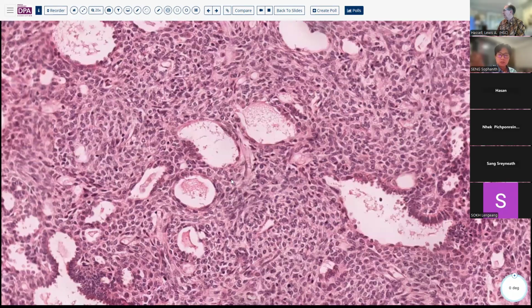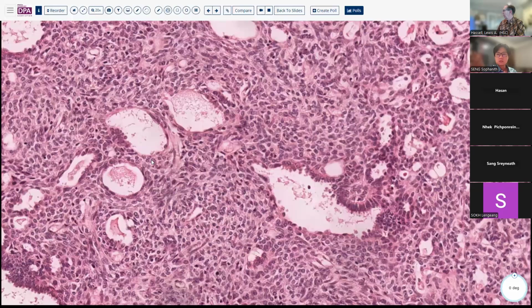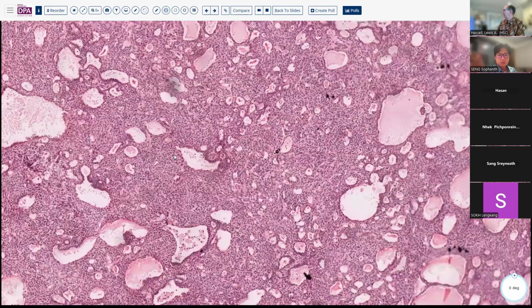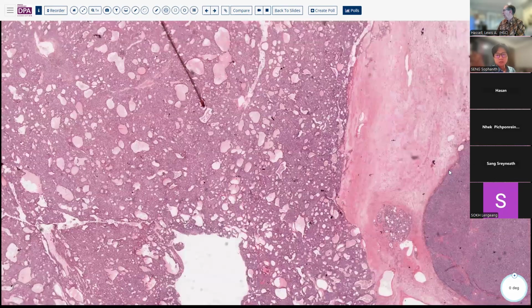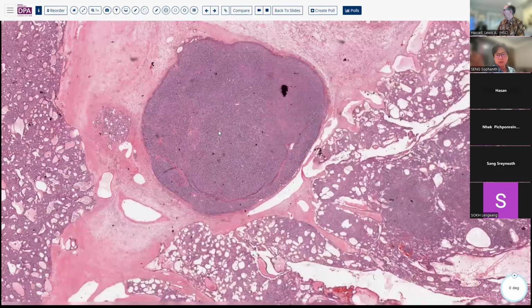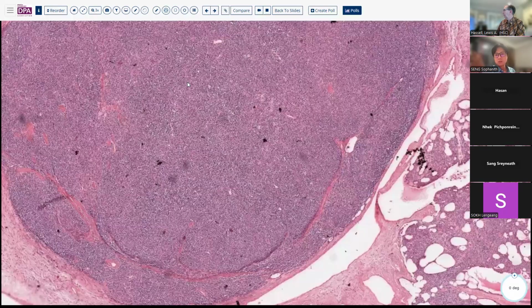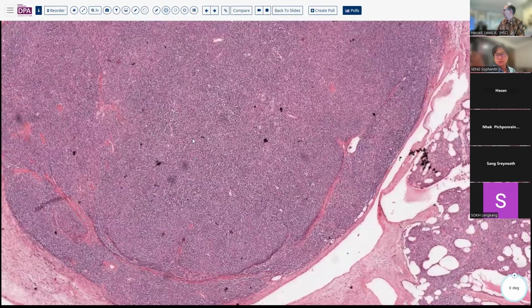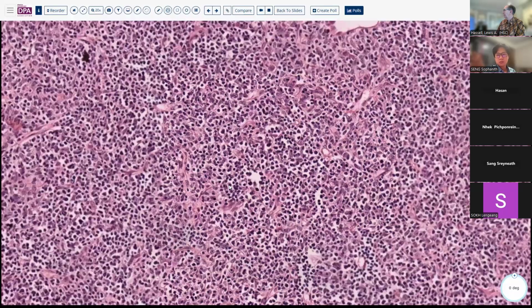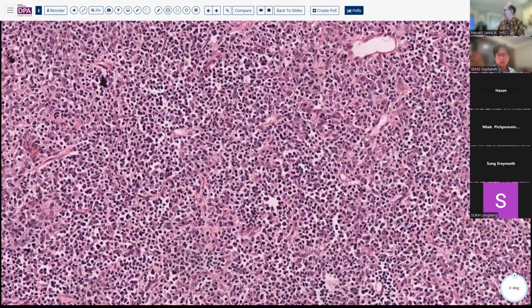So is this a type A thymoma? Well, we might think of that as certainly a possibility here, certainly very predominantly epithelioid. But notice here we also have an area over here where this doesn't look like normal thymus. I apologize for the dirty slide here. And we've got a much higher admixture of lymphocytes amidst the thymic epithelium.